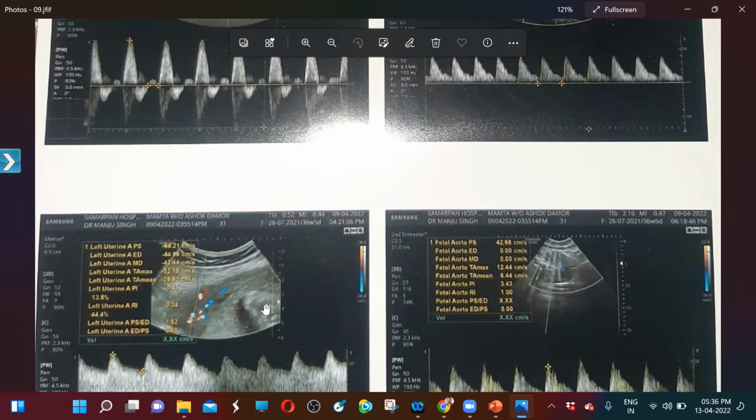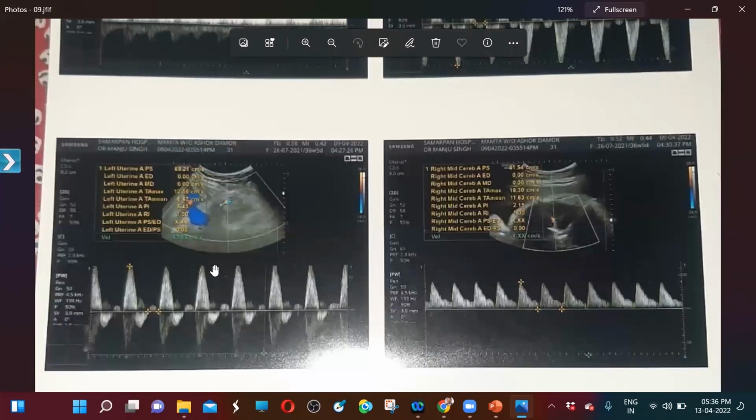This is actually the right. So the abnormal uterine artery is over here. It means that there is an impaired trophoblastic invasion. So this fetus should have IUGR. Which IUGR? Asymmetrical IUGR. Now I will not take the complete color Doppler over here because I will start talking of color Doppler and will not stop even for the next 24 hours.